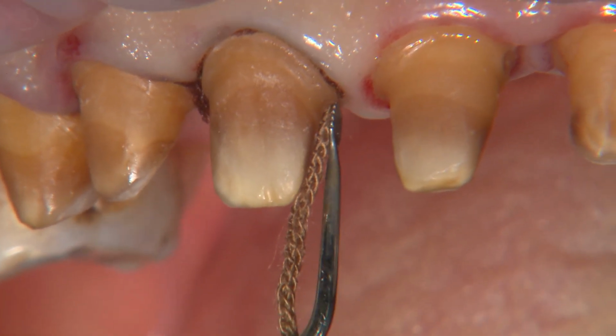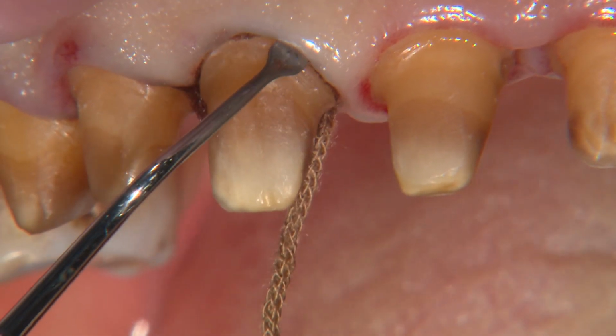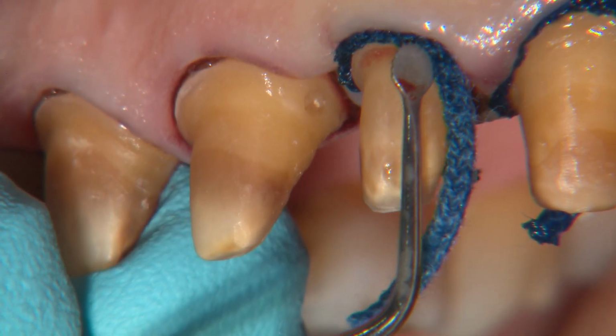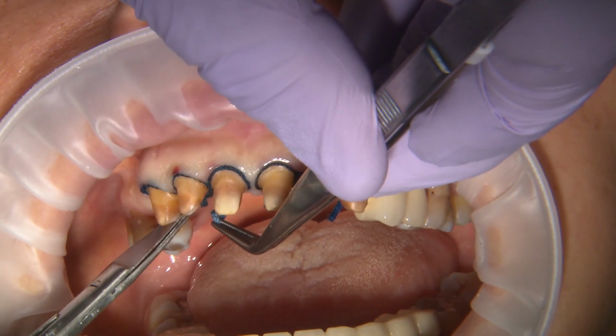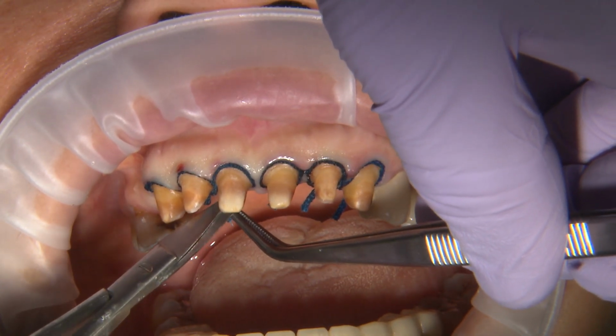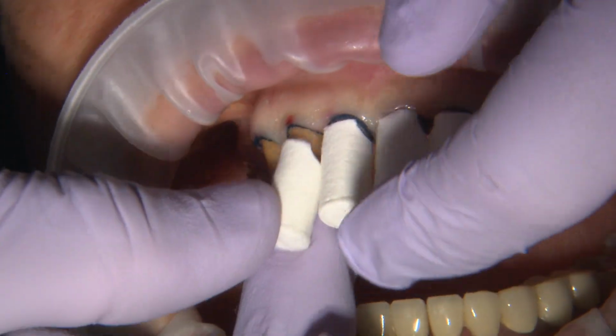In the meantime, while I have been entering all the prescription information, our dentist has been placing the retraction cords and preparing for the scan process. The double cord technique is being used for these units today. Proper retraction is so critical because we really need to capture all details of these margins, and we don't have the luxury of injecting impression material into the sulcus to make up for any overhang of tissue.